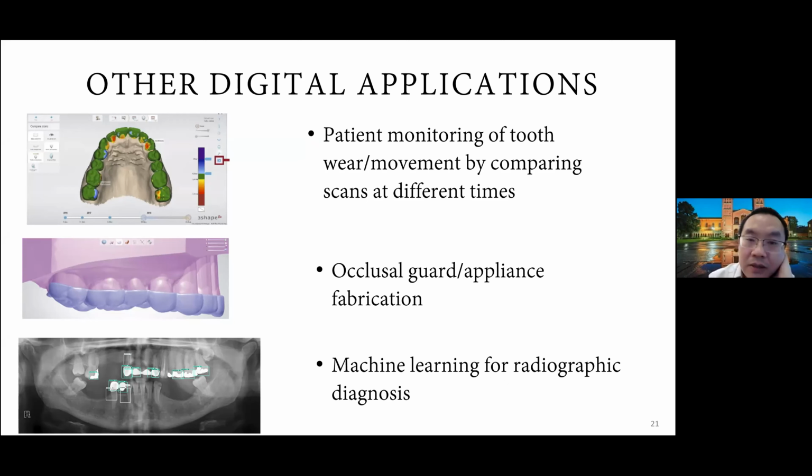So as you know, if you have already practiced in the clinic for a little bit, sometimes it's borderline, it's a little bit ambiguous whether or not there's actually a radiolucency, right? So this hopefully is a future in the sense that it will increase accuracy and reduce the human errors in terms of diagnosing caries on the X-ray image. But I will also lay out the challenges with this.